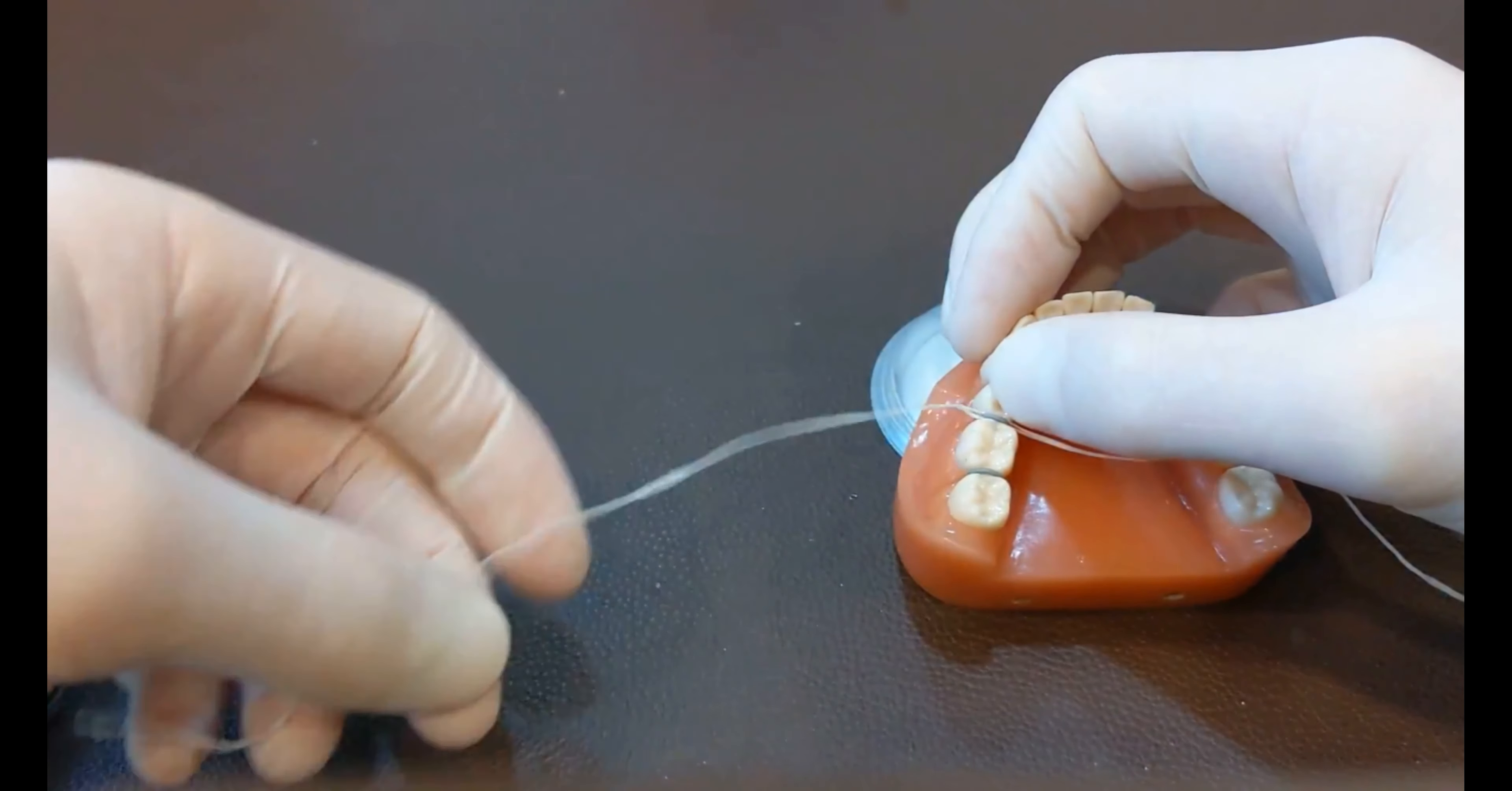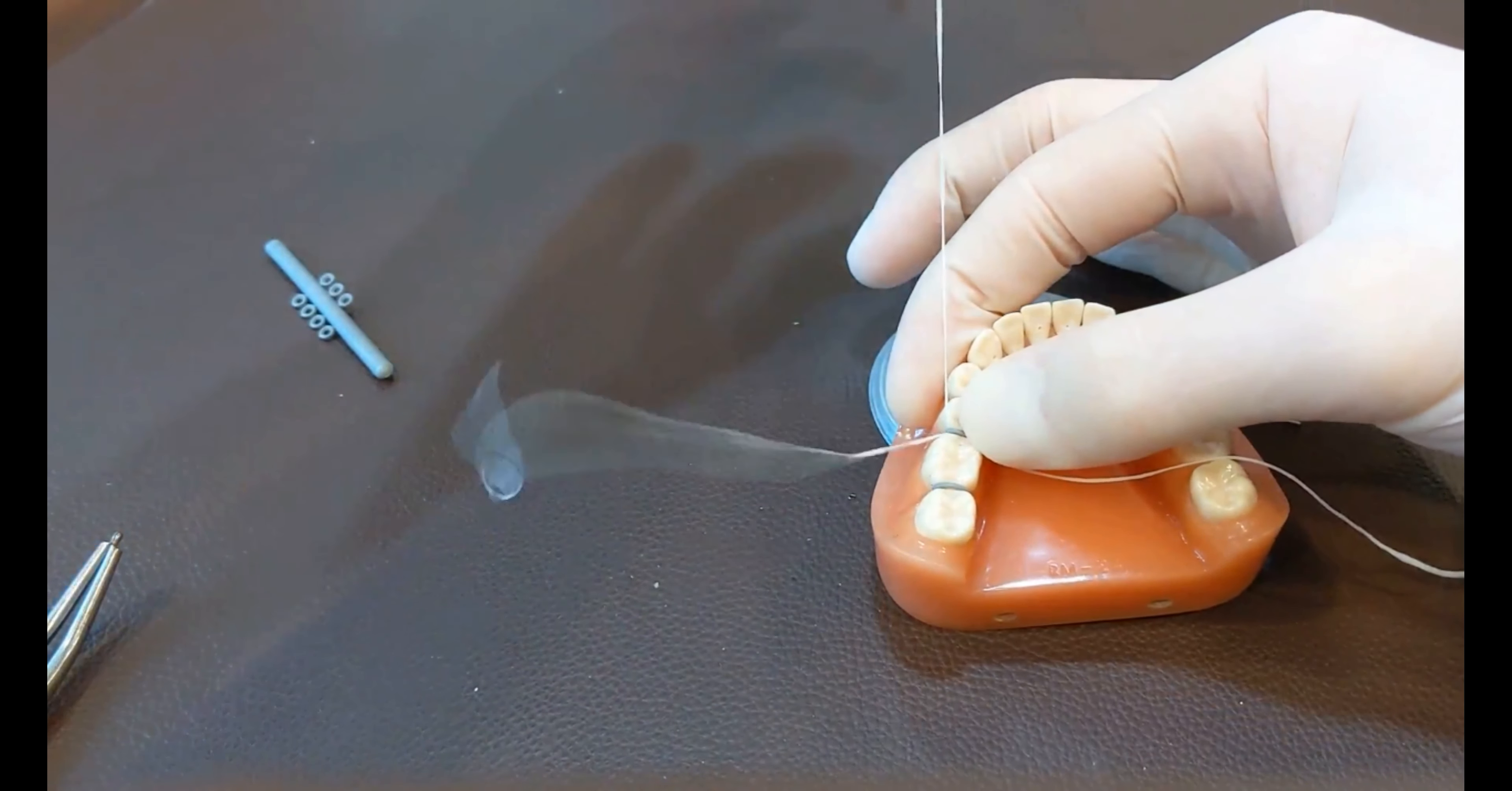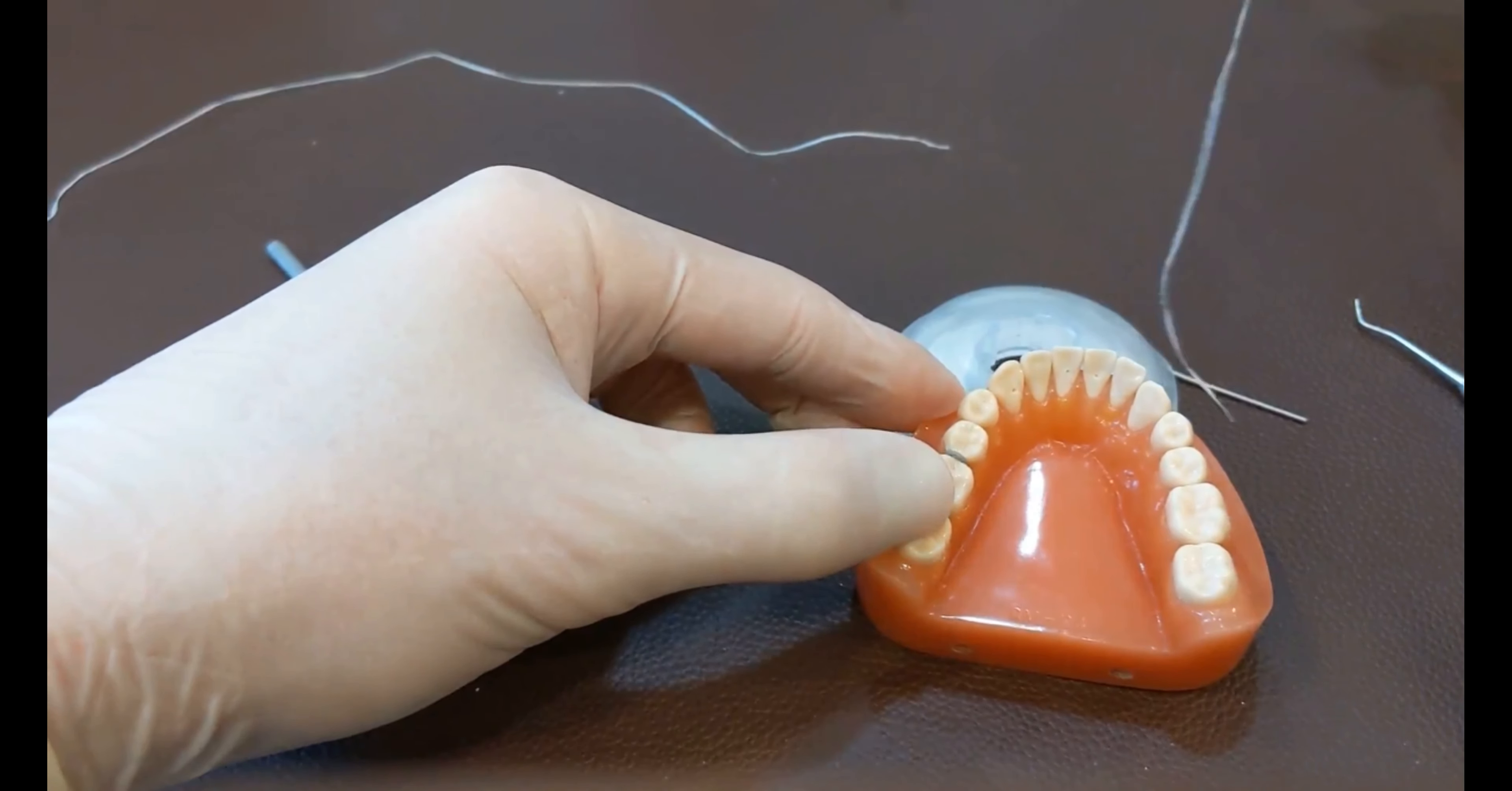Then you take your floss, you separate the two halves, and usually they're kind of wound up. So then you'll unwind them like this. And then once they're nice and unwound, then you just pull it straight out of the patient's mouth. And you do that with both pieces of floss. And don't pull up or down or you can dislodge the separator. You just pull straight forward. So you'll just pull straight forward and it'll slide right out of there like that.